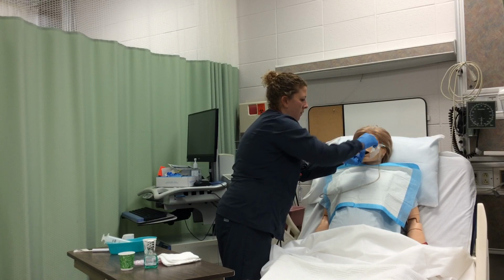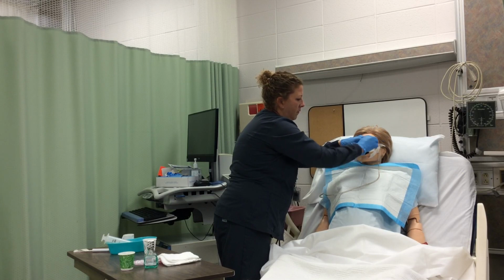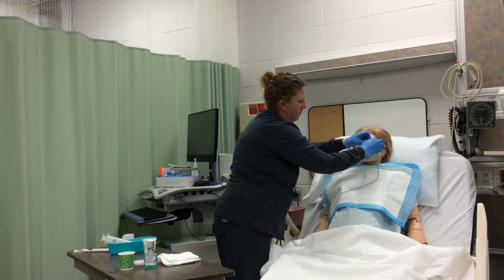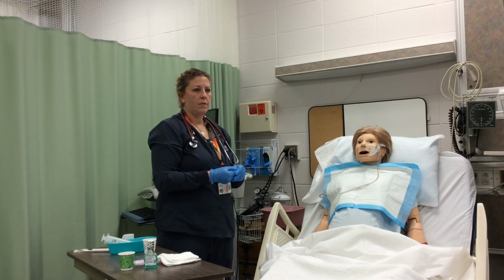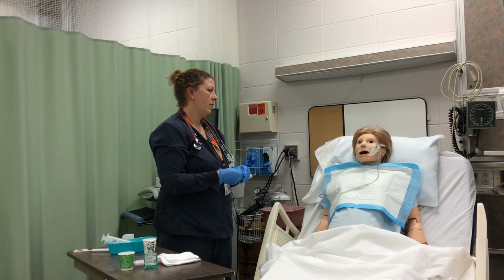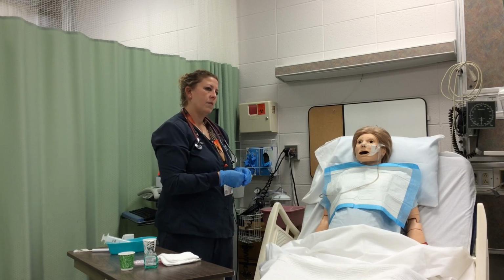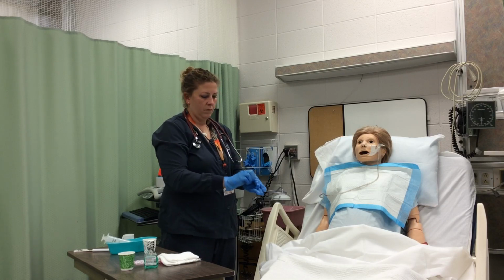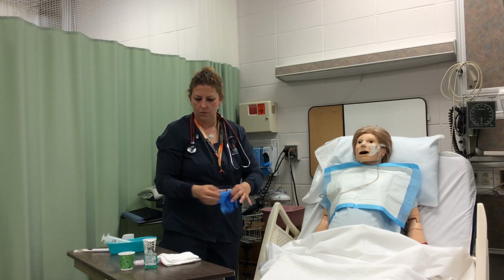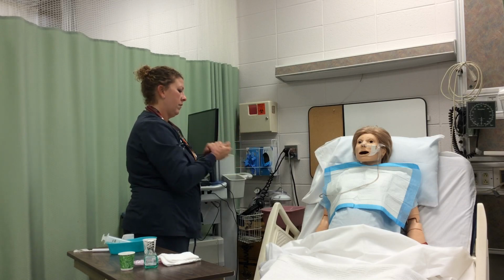Sarah's wrapping around the tube with the tape. There's also a possibility of using a tube fixation device, and that just slips the connector around the tube where it exits the nose. Label the tubing at a site close to the patient. She removed her gloves and did some hand hygiene there.